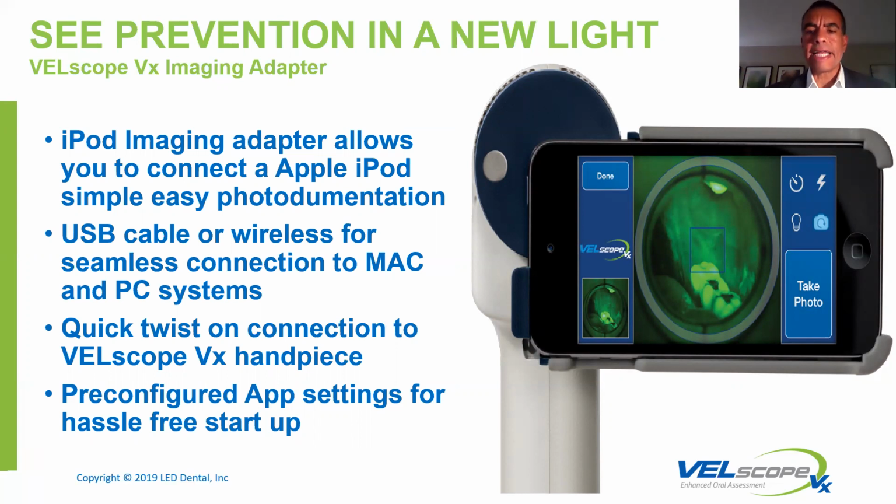What we found is that those issues of not knowing what to do have been dramatically reduced, because the oral surgeon knows that if there's cancer and I don't take a biopsy, even though I have a picture that shows it, it doesn't put me in a good space. So photo documentation is so critical, both for you in terms of managing those patients from one visit to the next, has it changed size, has it changed shape, to communicate to patients, and we'll talk about that a little bit further, and then obviously to communicate outside of the practice if necessary for a potential referral.